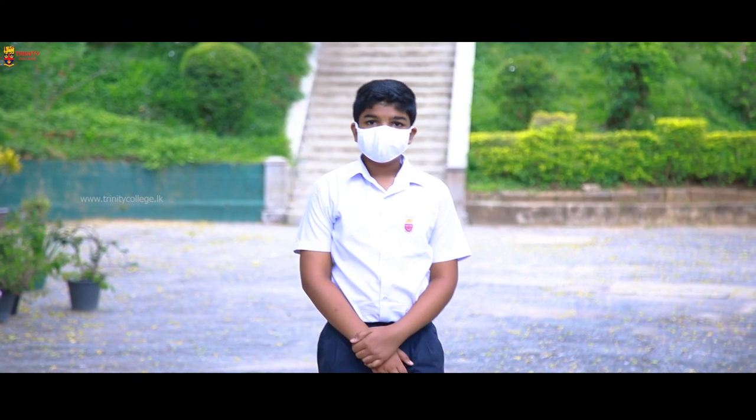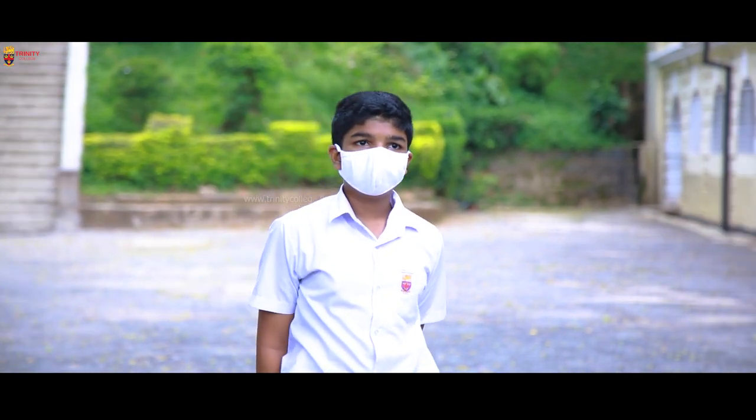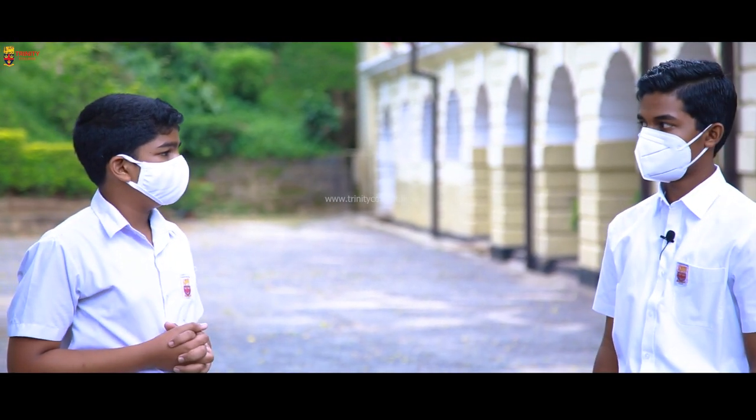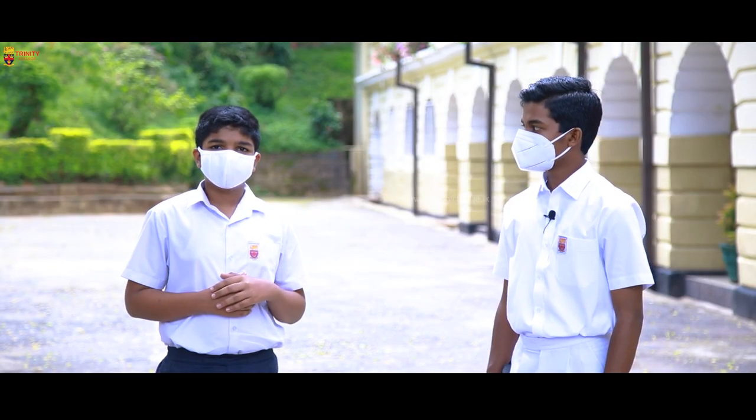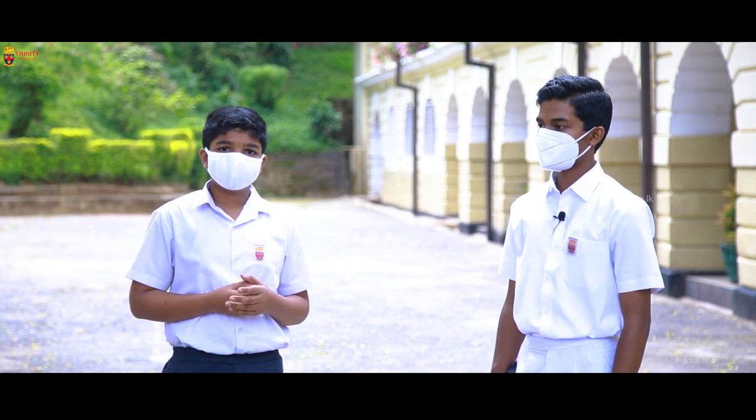Hello everyone, I am Jason Navaradana. Today we are joined by a young inventor who just a few days ago invented a wireless stethoscope. Thank you Venura for joining with us. Since Venura's invention caught a lot of attention, we thought of interviewing him to know more about it.